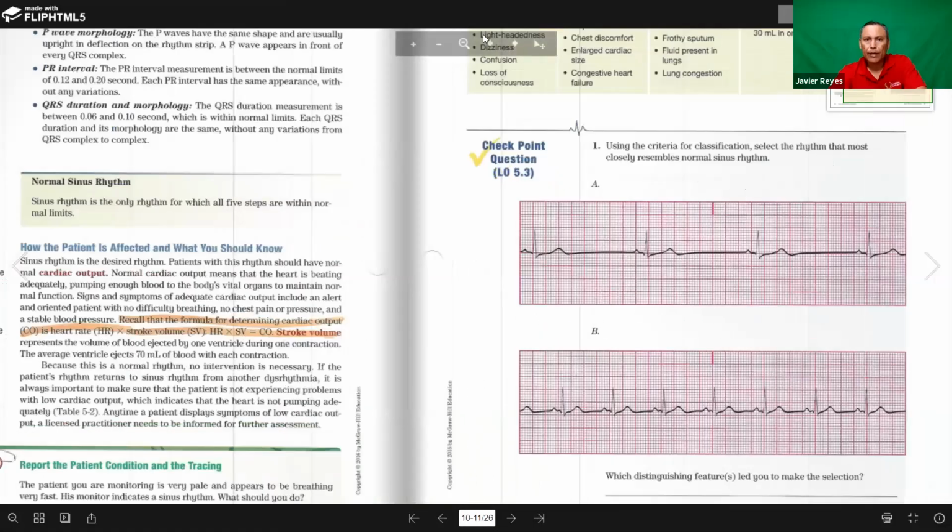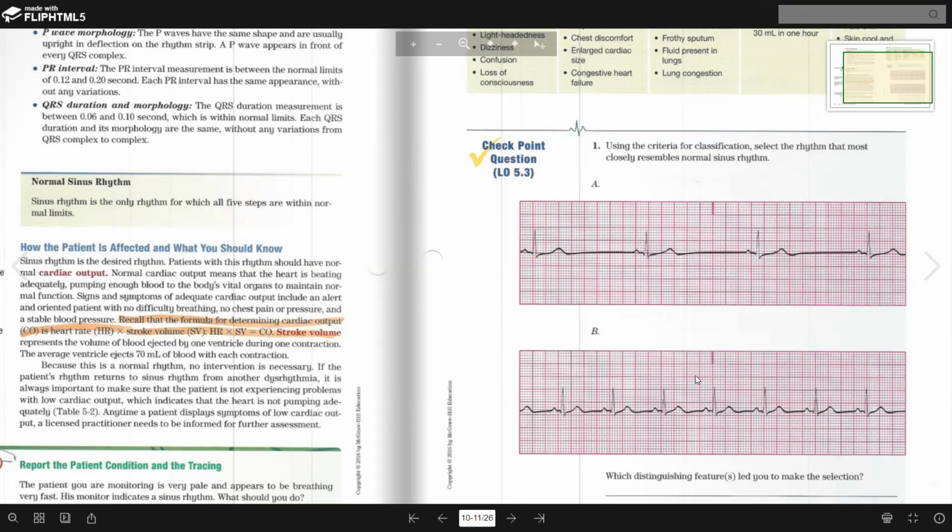Very good. So there you go. So now you see. Can you see my pointer? Yes. Okay. To use the 1500 method, Norma, remember what we have to do? We have to count the little squares. If you can't count the little ones, you count the big ones. One big one is how many little squares? 5. So we got 5, 10, 15, and let's say about 4. So we got 19 little squares into 1500. What is the answer? About 79, exactly.